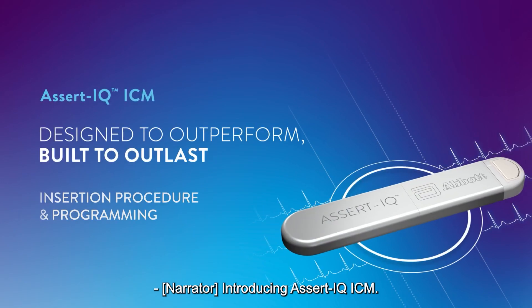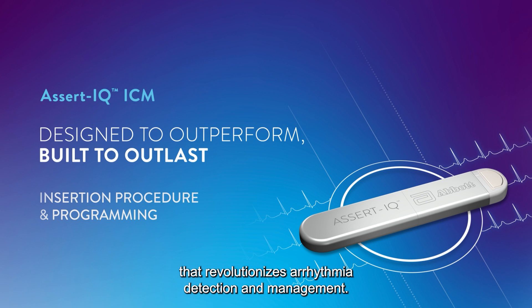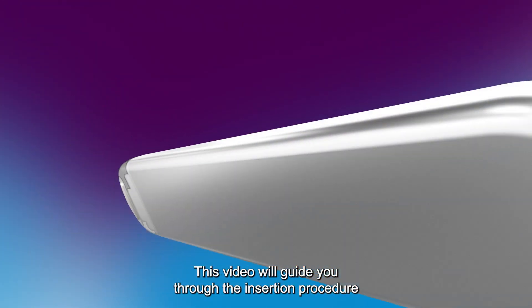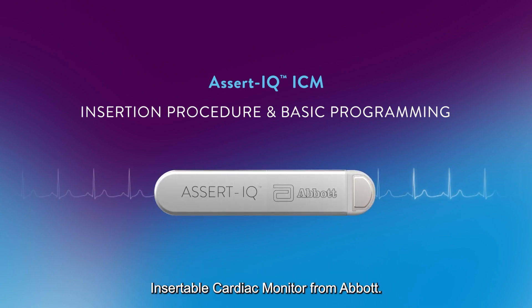Introducing Assert IQ ICM, the intelligent cardiac monitor that revolutionizes arrhythmia detection and management. This video will guide you through the insertion procedure and basic programming for the Assert IQ Insertable Cardiac Monitor from Abbott.